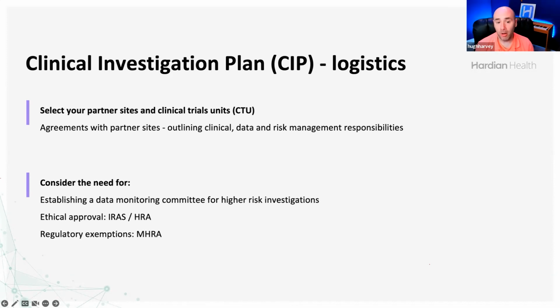Typically, you will need to partner with some kind of clinical site or partner site. So if your device is aimed at secondary care, this might be a hospital. If it's aimed at primary care, it might be a series of GP practices. If it's directly aimed at patients, then you might want to invite patient and user groups. You need to have formal agreements with all of these partner sites. And you need to really well document who's in charge.